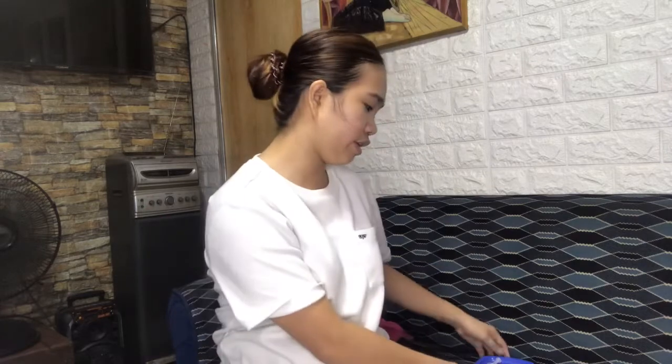So next is let's organize all the equipment or the materials that we'll be needing, and here are my things that I did prepare. So these are the cotton balls and the syringe with the medication. Next is, let's provide the client privacy, and also let's prepare her with regards to the side effects and to the procedure that we'll be doing to her. So prior to performing that procedure, let's introduce ourselves and verify the identity of the patient.